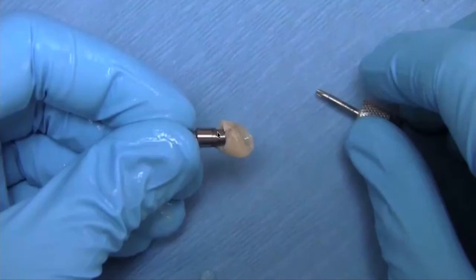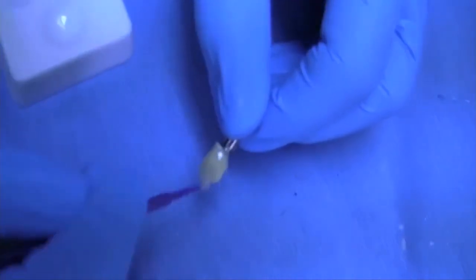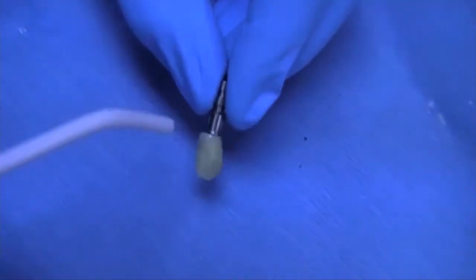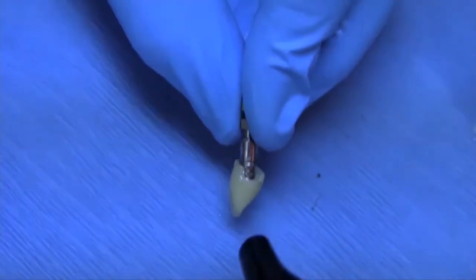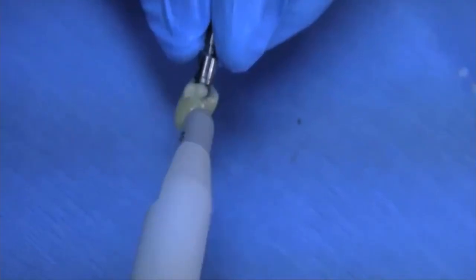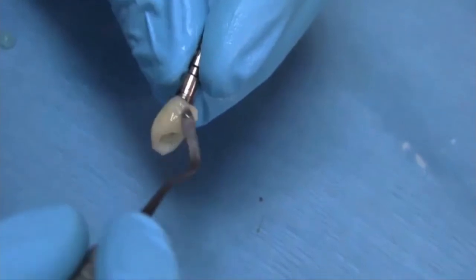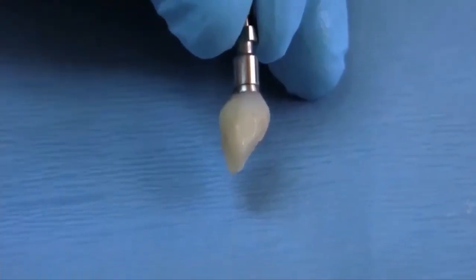and you can see the discrepancy between the finish line of the abutment and the actual crown of the patient. So we're going to have to do a reline procedure, and in that reline procedure we need to build what is called the emergence contour and the emergence of the crown. For this purpose we utilize a resin, and try to select a resin that matches the color, and try to create the best emergence profile for that crown, so you can transfer that to the soft tissues and maintain the soft tissue profile that you had in the original crown, minimizing changes in the perioprosthetic environment of the restoration.